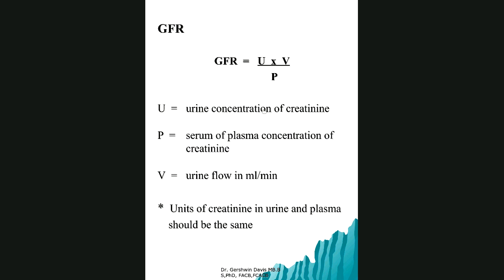Okay, this is UV upon P. This is the volume of urine in mils per minute. So you may have the whole collection done correctly, but if your calculation is wrong, you can get it wrong because of your units, or because the urine flow was not considered as mils per minute. You can get it wrong. Okay. I mention this because urine is so common, and there are other things that you may want to do a 24-hour urine collection for. So please note, that's a note to self.